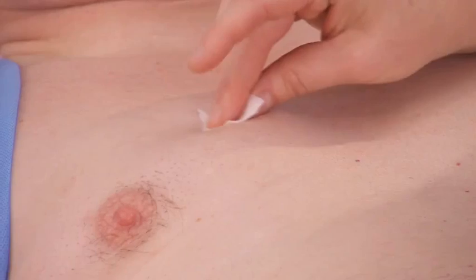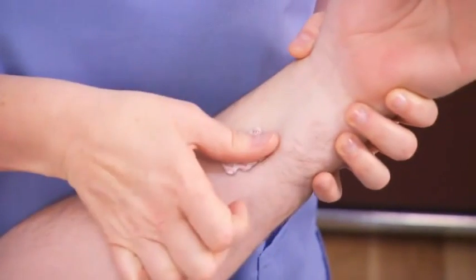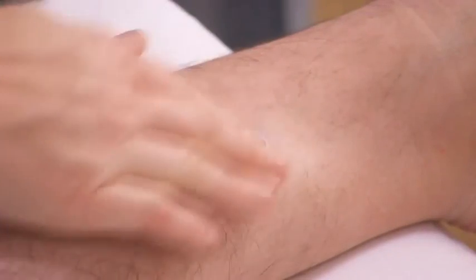Discreetly expose the patient's chest and extremities. Prepare the areas where the electrodes will be placed by cleansing the skin with alcohol wipes. Apply the self-adhesive electrodes to the extremities.